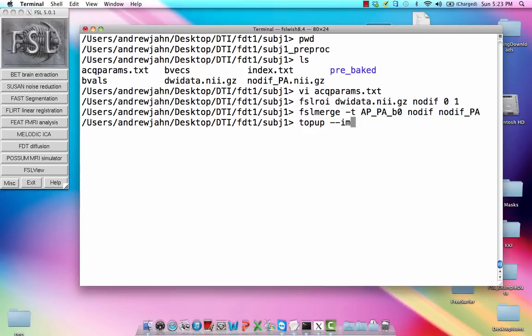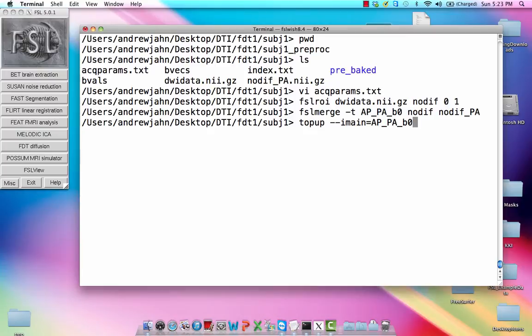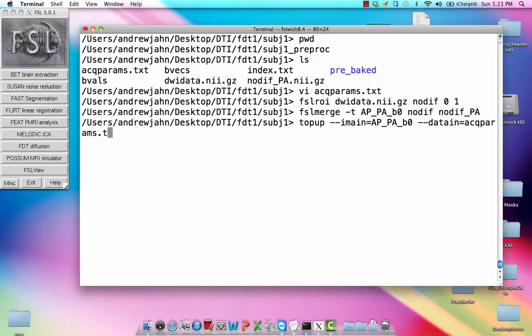So top-up requires a couple arguments. For instance, the image in is going to be this AP, PA, B0 image that we used to, that was a combination of these different encoding directions. And also, it needs this parameter file. Remember, this is something that comes with this tutorial data set, but this is something that you will need to get on your own from your scanner technician.